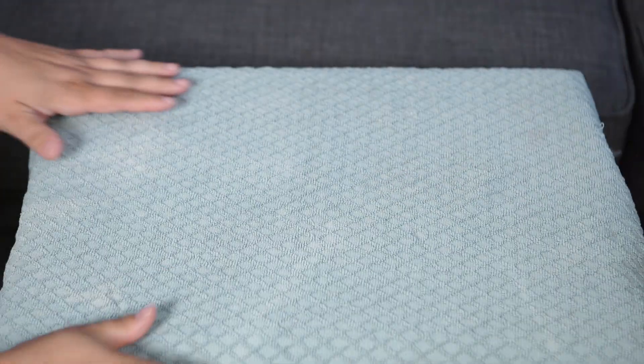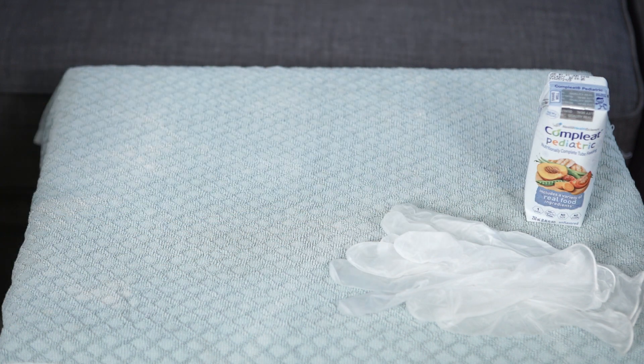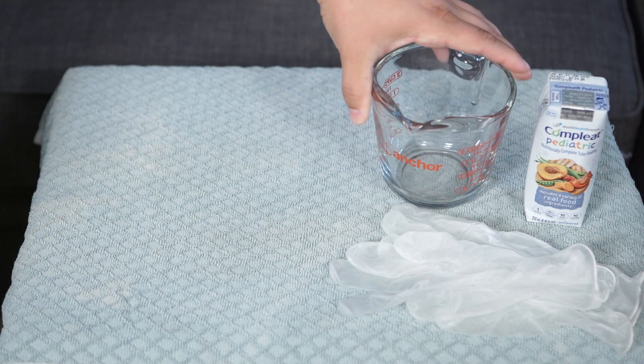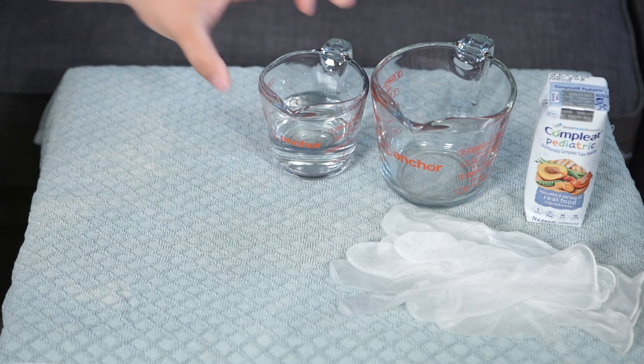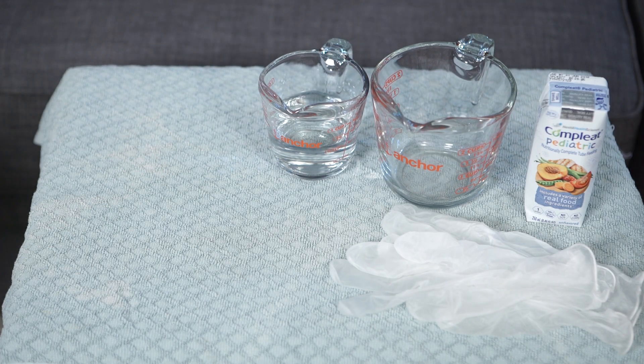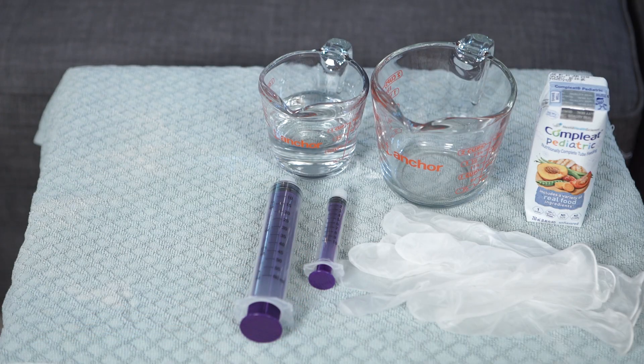Assemble the supplies you need for the bolus feeding: non-sterile gloves, formula, a clean container such as a measuring cup for the formula, another clean container with the type of water recommended for flushing the tube, a small syringe, and a large volume syringe.